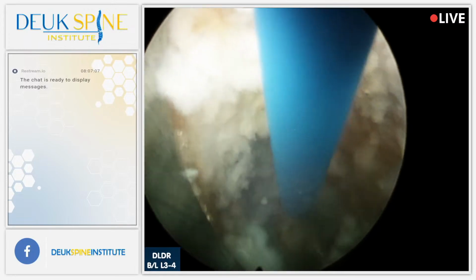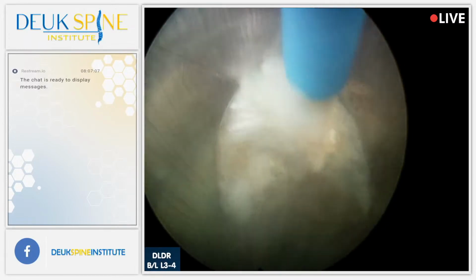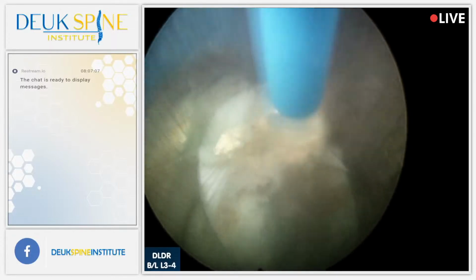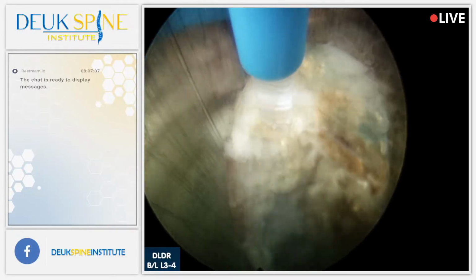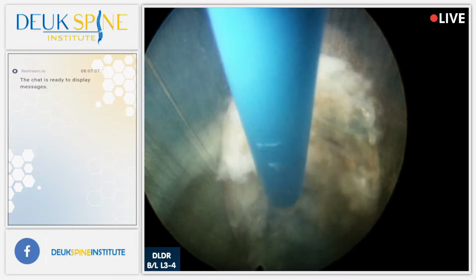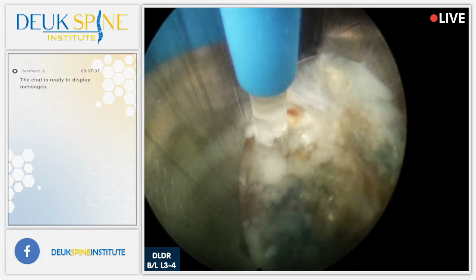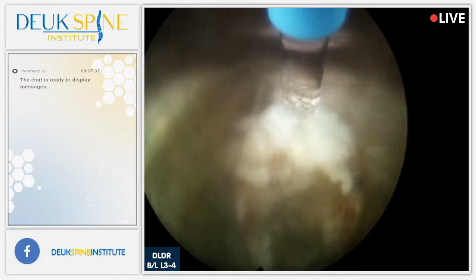But the same thing happens with drills, right? Everyone's used a drill before, and you're drilling a piece of wood. If you just keep drilling it, it could start a fire because the frictional forces create heat energy. You see people drilling metal all the time. They use oil as a lubricant, and the drill bit is constantly bathed in oil. Well, the same thing with a laser. It's no different.